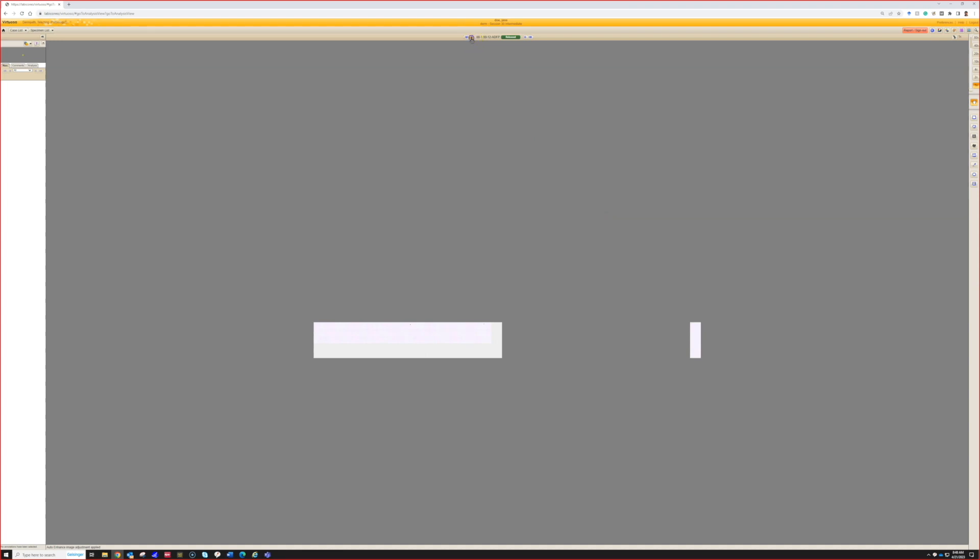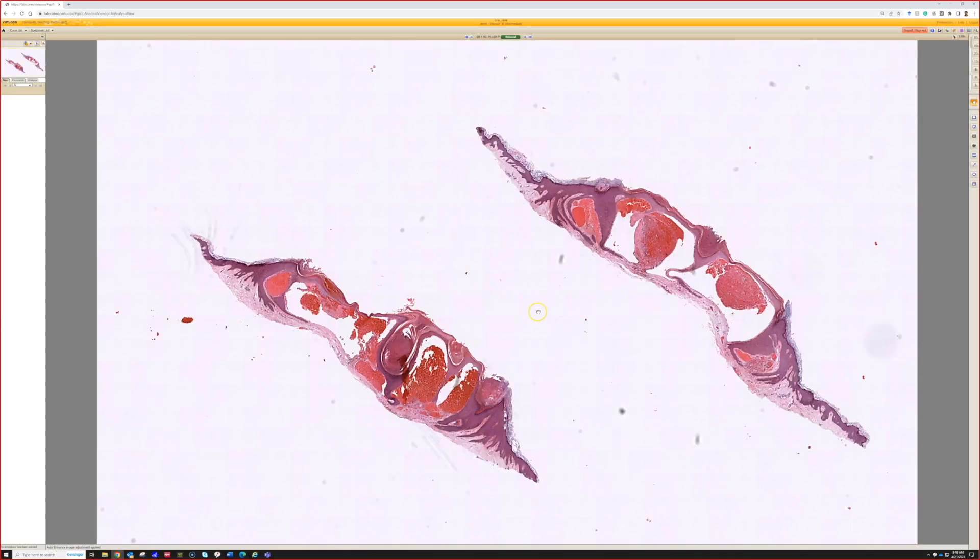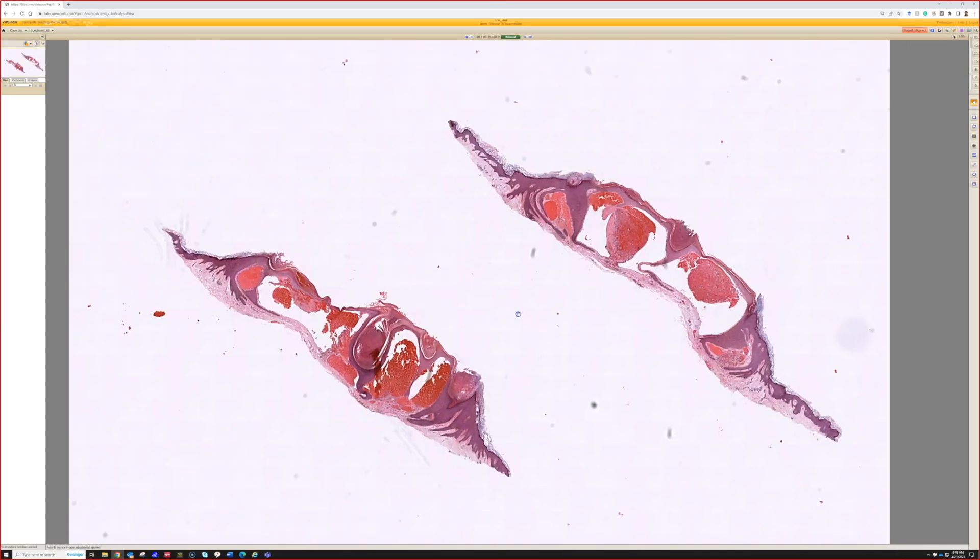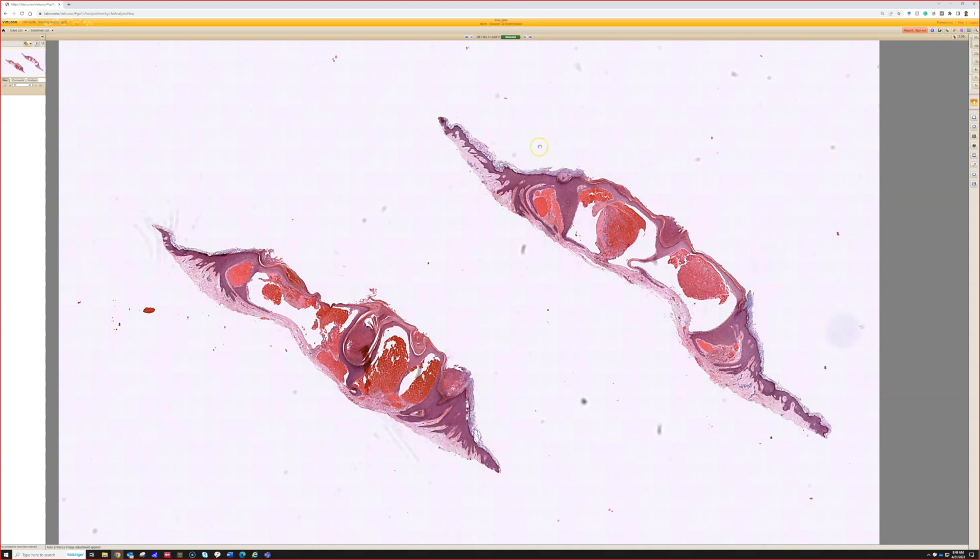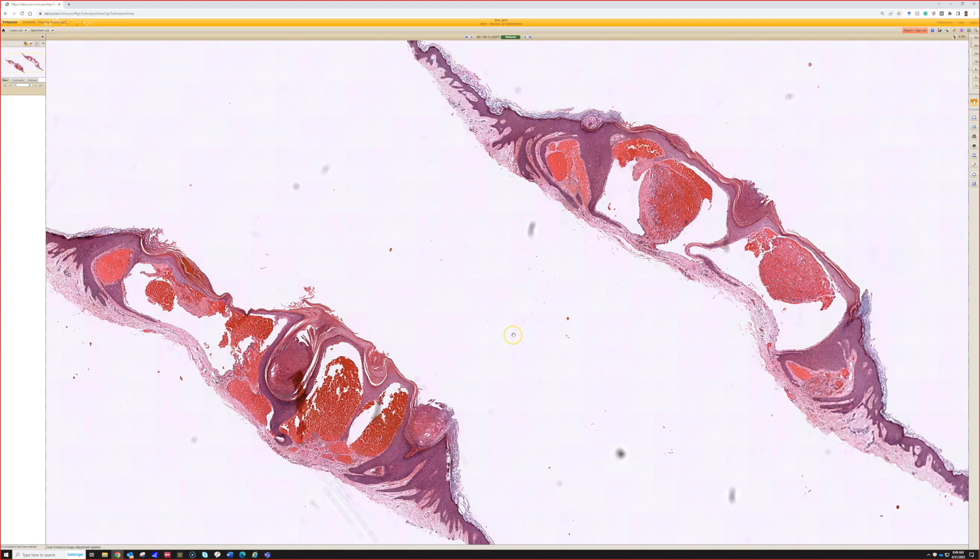Oh, and again, if you have something that looks like this and it's a radiated site, then the answer probably is actually atypical vascular lesion, post-radiation atypical vascular lesion. So the context really matters. So if I see anything that has channels like this and it's on the breast of an adult, I want to check and find out that they have a history of radiation because a lot of times you're not told that information. Sometimes the dermatologist may not even know for sure. So if I have access to the chart, I usually will go and look just to make sure there's not a radiation history.